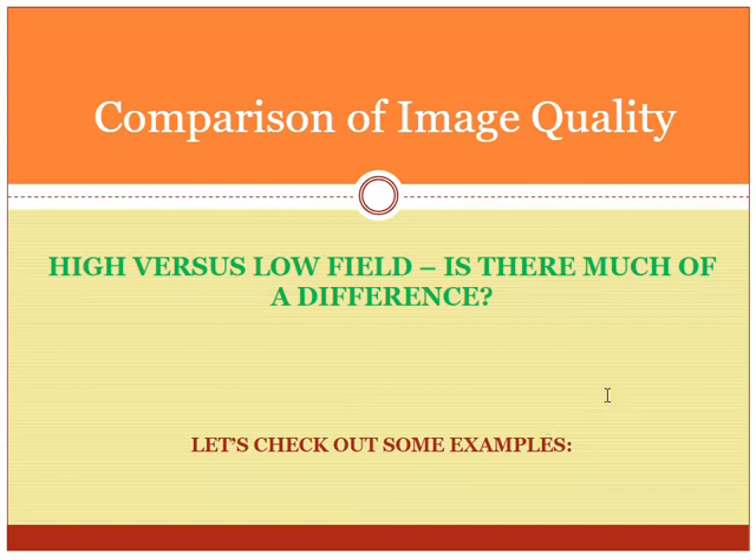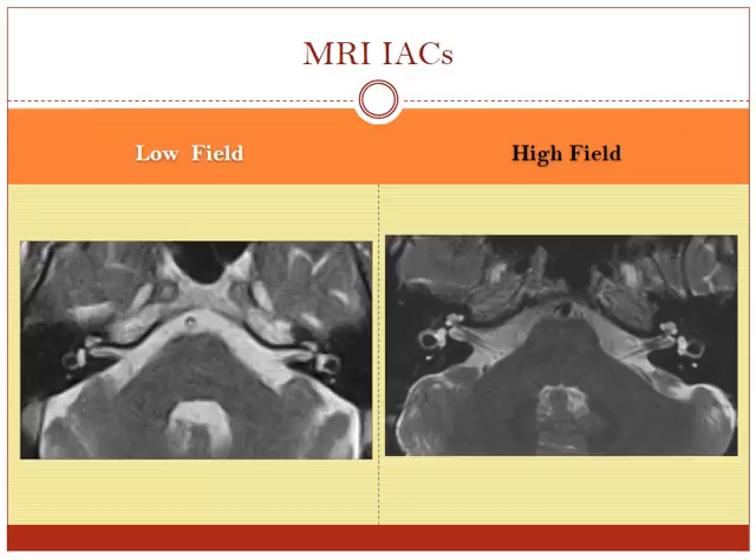Now I'd like to go over some of the images from a high field versus low field and show you the difference. That high magnetic field strength from the closed scanner, the doughnut type scanner, does provide better image quality. I'm going to show you a view here of the internal auditory canals — we have the low field scanner on the left hand side and the high field scanner on the right hand side.